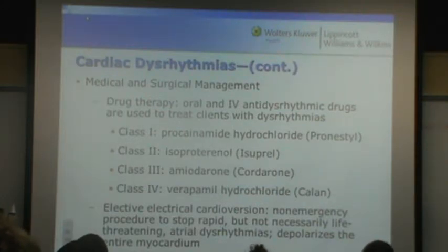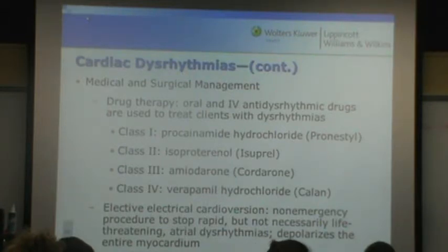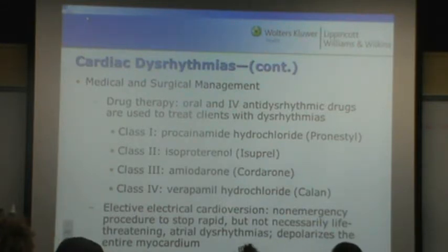And then there are times when our patients are unstable to the point that we need to do electrical cardioversion. And remember that when it comes to cardioversion, it's not like the defibrillation we do with a patient that's in cardiac arrest. It's similar, but it's not the same thing. Let me back off real quick.